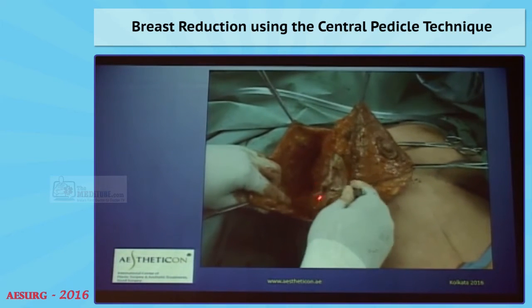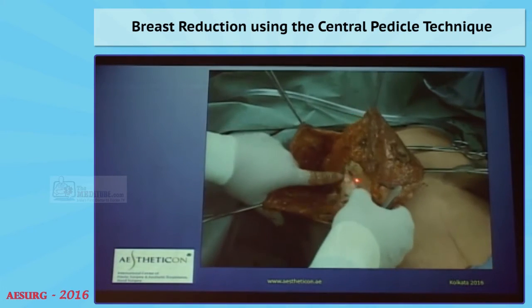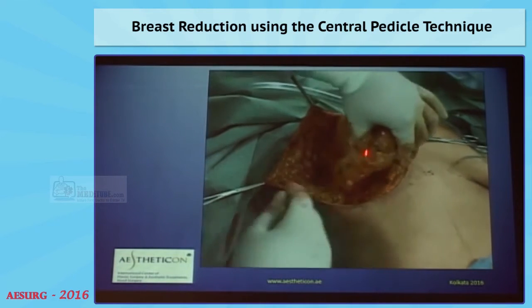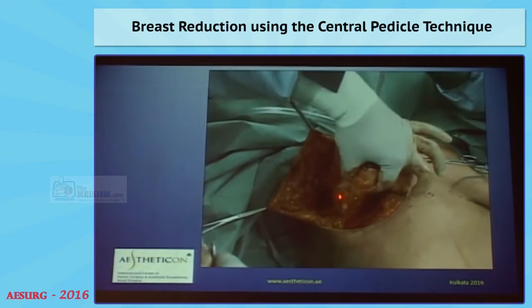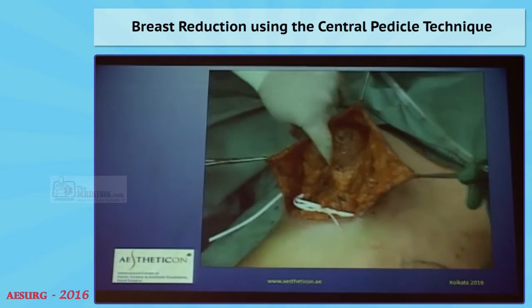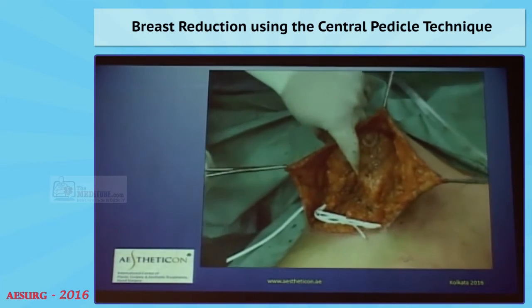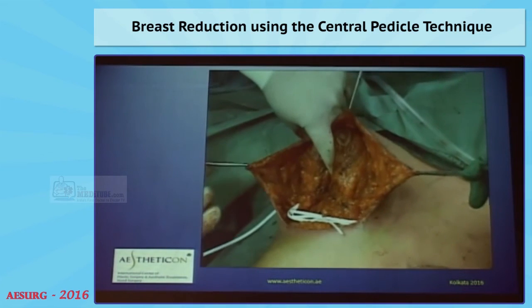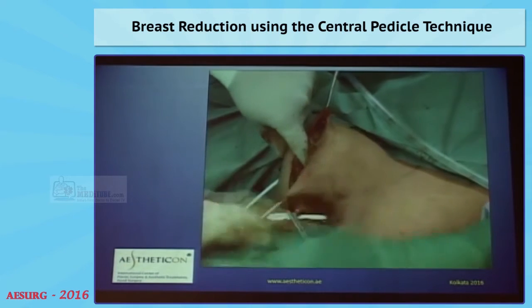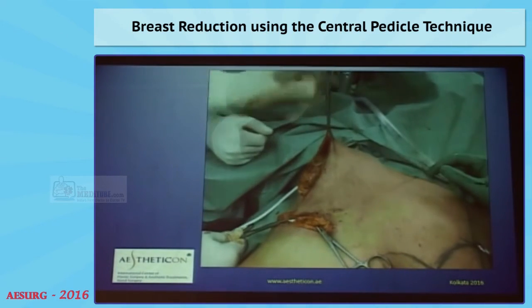I go all the way down to the lateral muscle. I keep this central part intact, where the perforators come from. And I keep this strip here intact — notice please, this one is important. This is where the sensory nerve pierces through the muscle and finds its way to the nipple. So if you preserve this bridge, you preserve the sensation to the nipple.